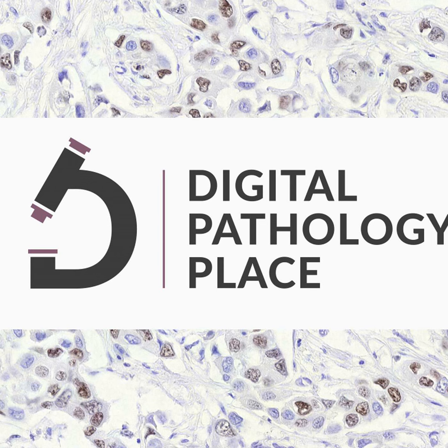In the field of digital pathology, collaboration and data sharing are instrumental in broadening the scope and depth of research. Remember, collaboration was the reason telepathology, the mother of digital pathology, was developed in the first place. The digitization of pathology slides facilitates collaboration among researchers, pathologists, computer scientists, and clinicians from different geographical locations and various institutions. They can remotely access and review the same sets of digital pathology images simultaneously, fostering more integrated and interactive discussions about disease processes, research findings, complex case reviews, and conclusions drawn from tissue image analysis results.